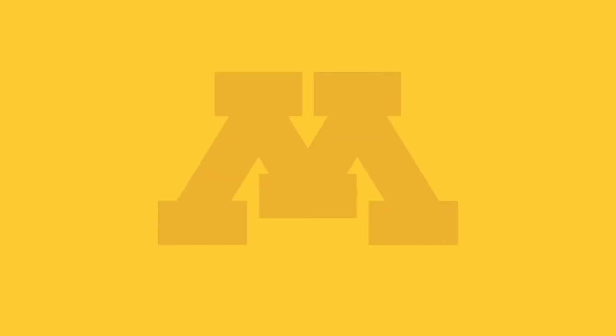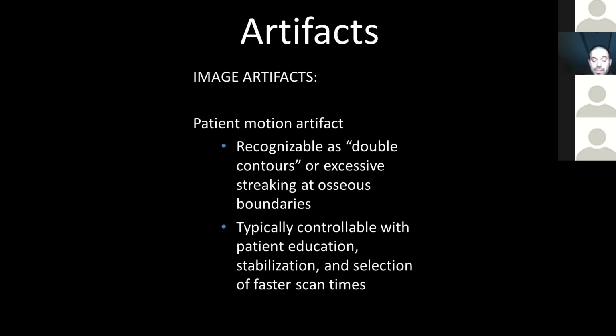The ways to control that are, of course, patient education and stabilization. So if you have a cone beam CT with a strap or some sort of head stabilization restraints, use those. And the sneaky strategy is using faster scan times. You can adjust those on cone beam CTs. What I mean by that is if you have a little kid or an elderly patient that can hold still for 10 seconds, but they can't hold still for 30 seconds, select the 10-second scan. We'll see in a little bit, there's an image quality penalty you get by selecting the faster scan time, but if the patient doesn't move, you're going to come out ahead.